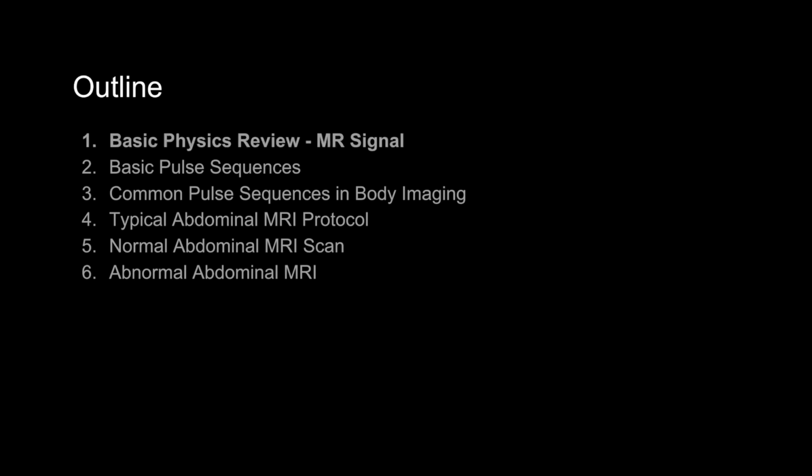Let's get started with some basic physics. This is going to be far from a comprehensive review. We understand that everyone has a different physics background, so we're going to assume no background. Even if you have a basic MRI physics background, I strongly suggest that you watch this video through. We will review only the most essential concepts.